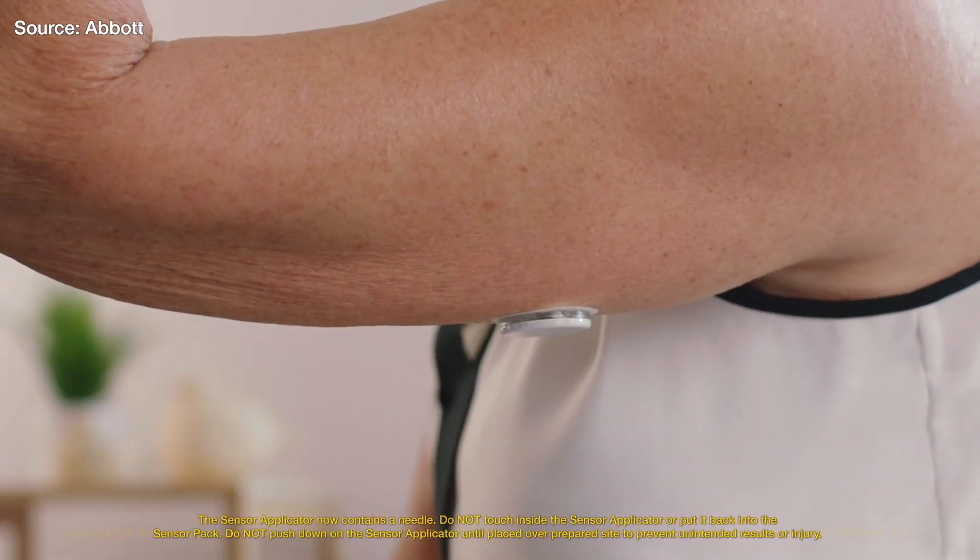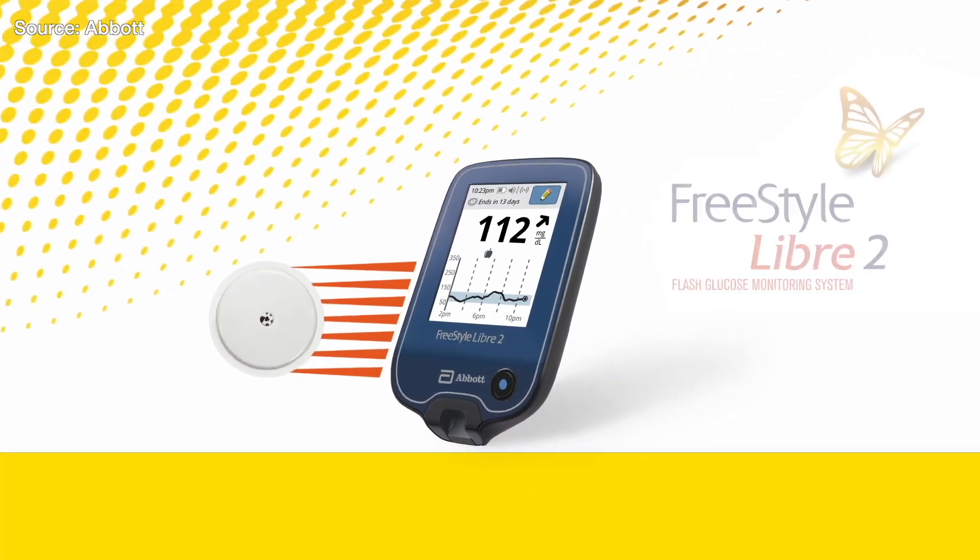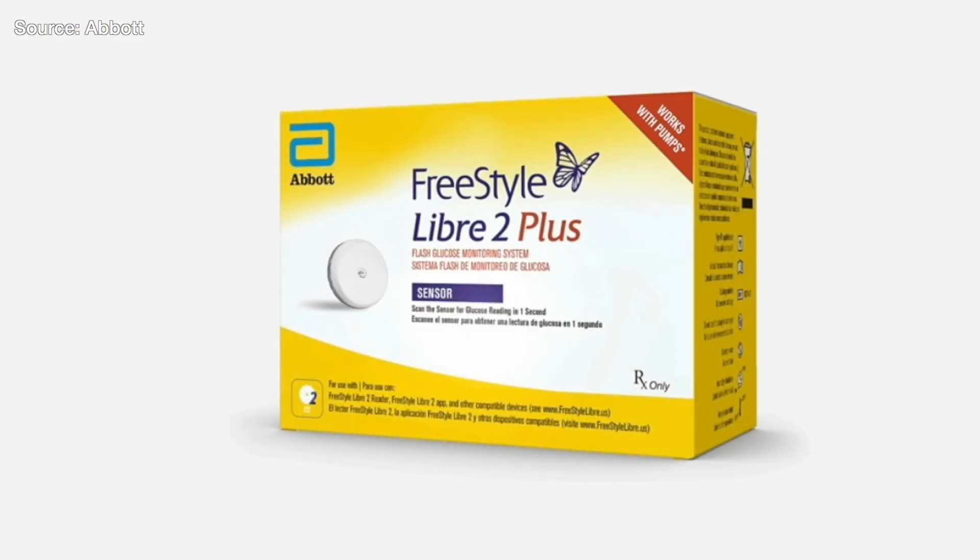Thank you so much for talking to me today about the Libre 2 Plus. A lot of people are asking, why the Libre 2? Why are we starting with that CGM instead of the Libre 3? Well, that's actually pretty simple. Libre 2 was around first and we've been working with Tandem for quite some time on integrating the two systems together. So we started with the 2 Plus sensor, which is now available. And we do have intention of moving towards a modified version of the Freestyle Libre 3 in AID integrations as well.